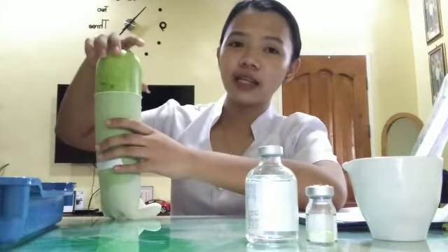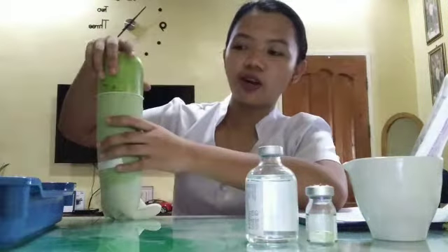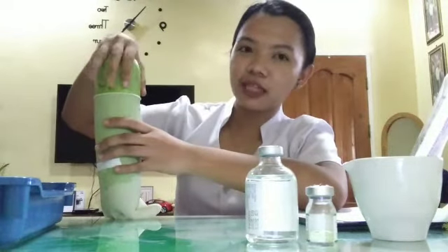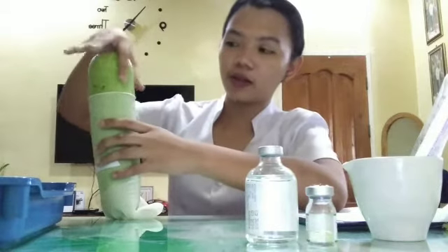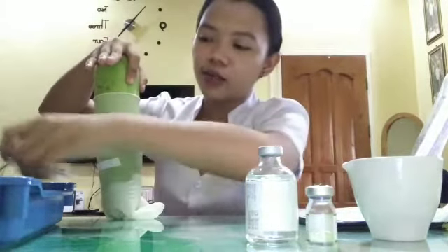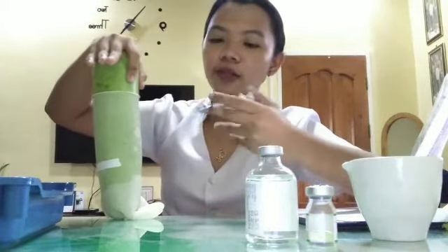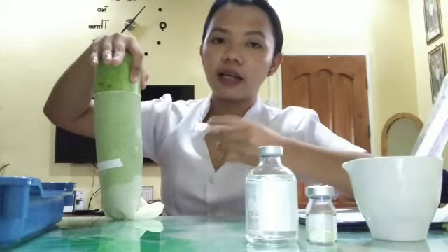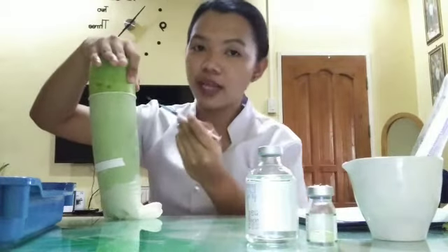In administering this subcutaneously, we need our non-dominant hand to grasp the fatty portion. We will grasp like this, and then we will uncap the needle and administer it at a 45-degree angle.